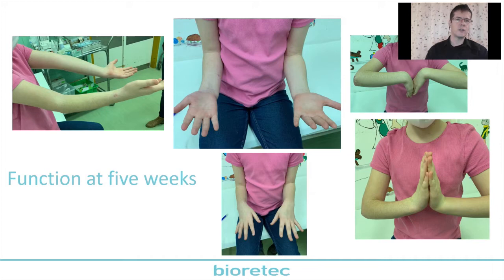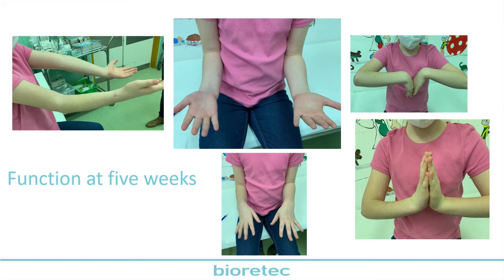The forearm function is almost perfect. There's only a small restriction of the elbow extension, but we think this is rather due to the supracondylar humeral fracture. And we hope within the next few weeks, this little restriction will decrease. Next slide, please.